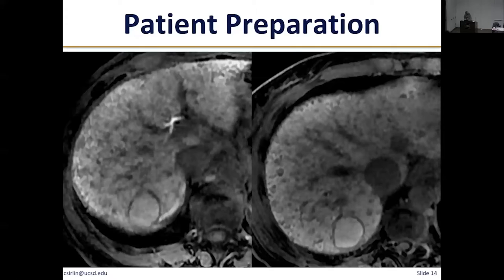Both of these were acquired in a 20-second breath hold. The images are exactly the same, except that in one case, I asked this woman to hold her breath in inspiration, and in one, I asked her to hold her breath in expiration. So which is which? In this case, expiration is on your right.